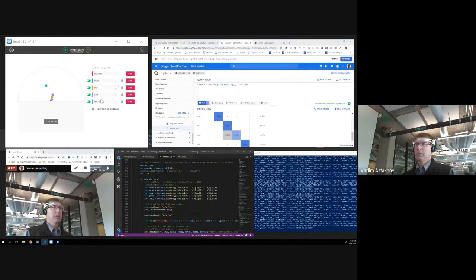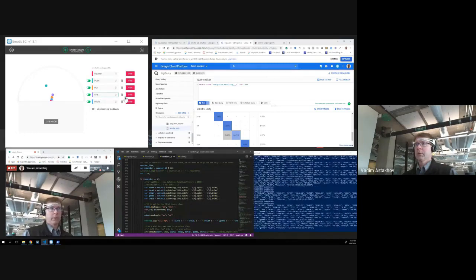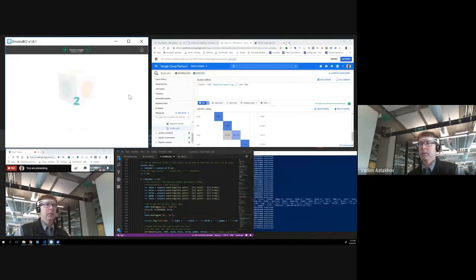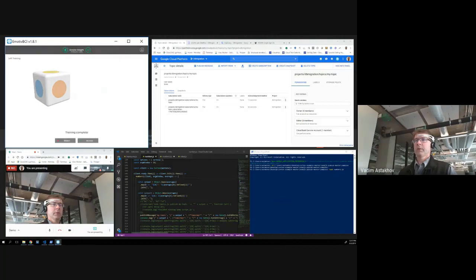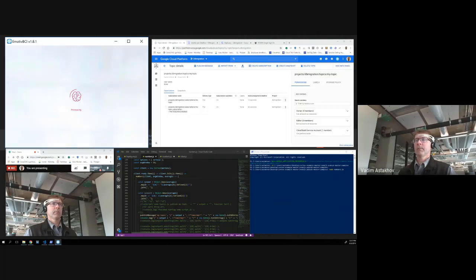So let's collect signals when I'm thinking about pushing an object to the left. So basically we use about a second. Let's start thinking about, now I'm thinking about pushing the mouse to the left, and the signal from the device will be collected. Now it typically takes about 10 seconds, so I can accept or I can reject a training. Let's say we accept that. So now this data is being stored.